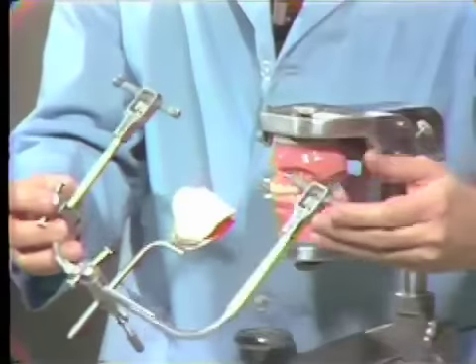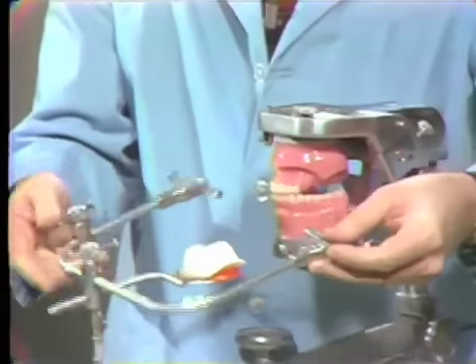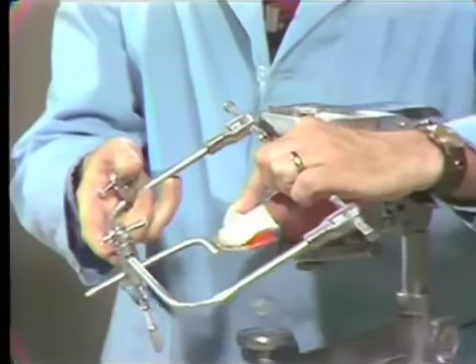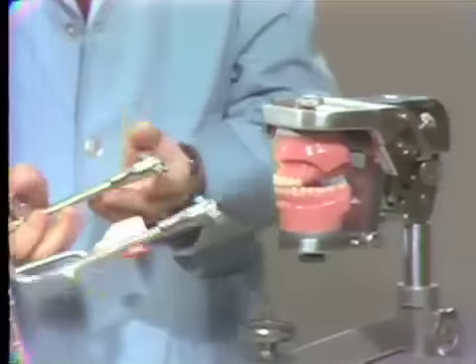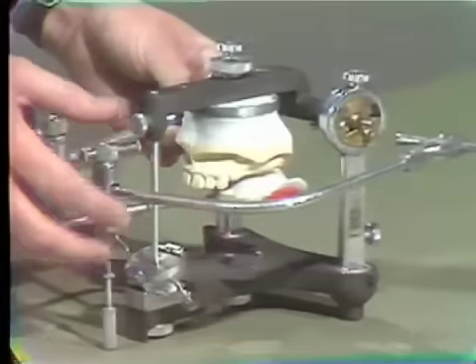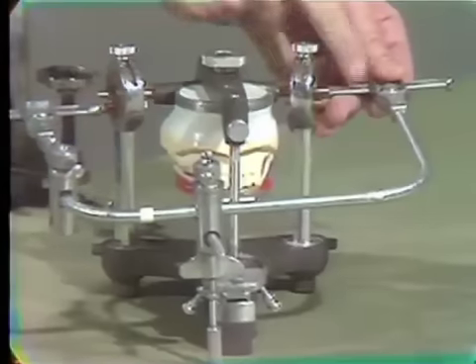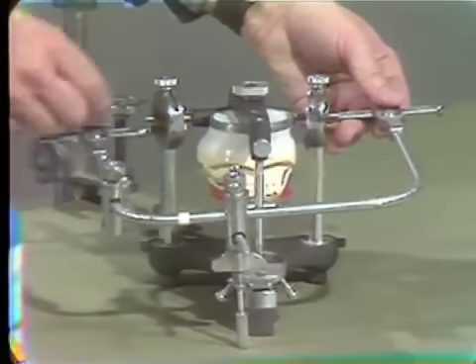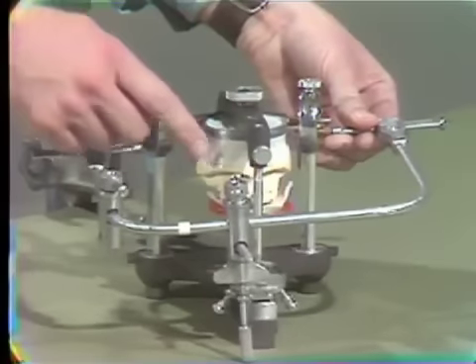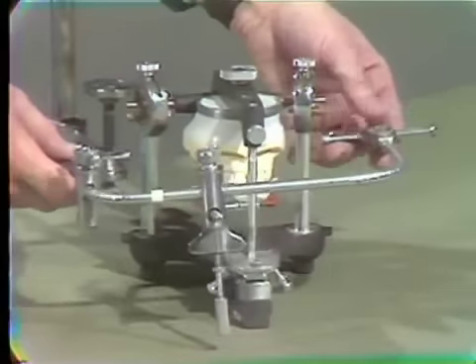This face bow and the other two just like it in the laboratory are all set to go on the Hanau articulator. All you have to do is place your master cast on the base plate and simply mount it to the articulator. The distances between the condylar rods have already been adjusted, so by just springing this slightly, they will go over the condylar rods and you can mount the upper in probably less than a minute with some impression plaster. Then pass it around to someone else in the class.